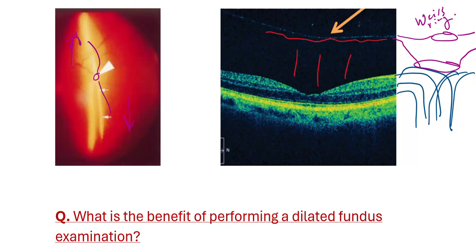ascension-descension motion. Now we come to a very important question. It's a high-yield question, in fact. What's the benefit of performing a dilated fundus examination? Well, you might think this is a very primary question.